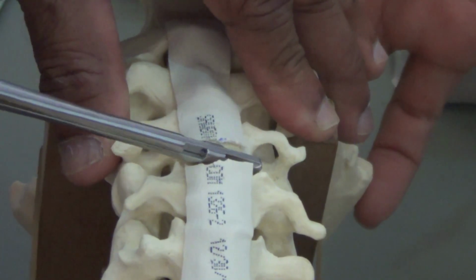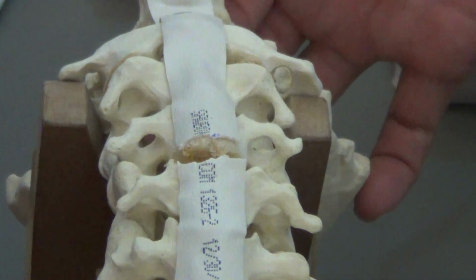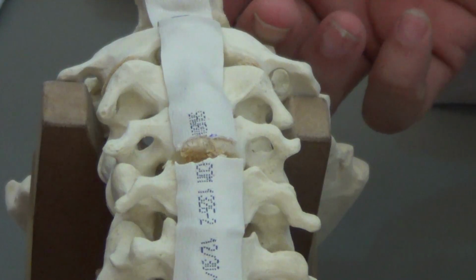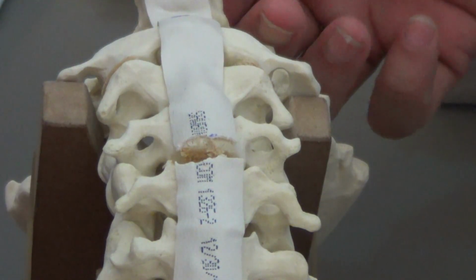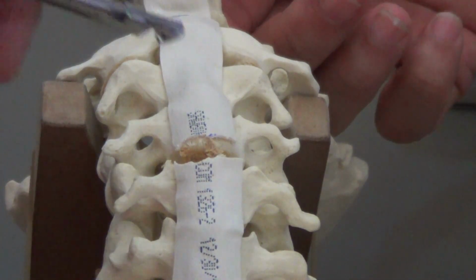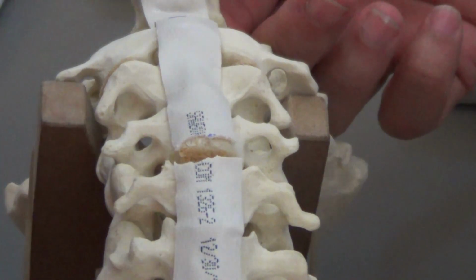It is usually prolapsed on the lateral side. I usually take out the posterior longitudinal ligament. How do you take it out? You can use a 1 mm Kerrison ronger, and slowly take out the posterior longitudinal ligament. In this case, you must be extremely careful.